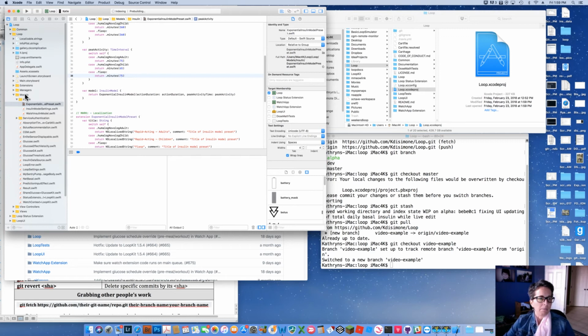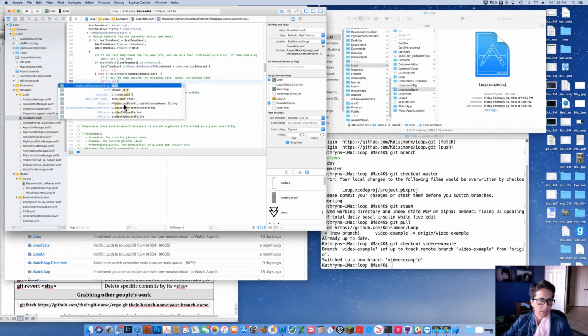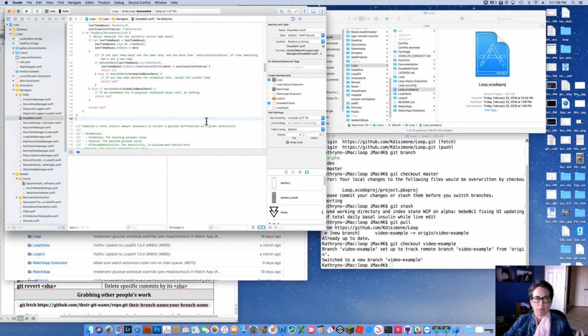Awesome. And maybe I want to change my dose math to have neutral temp basals set. So I'm going to set neutral temp basals. So these are all customizations that you can do. They're in the Loop docs. When you build, you can customize those. So I can see that these have been modified.